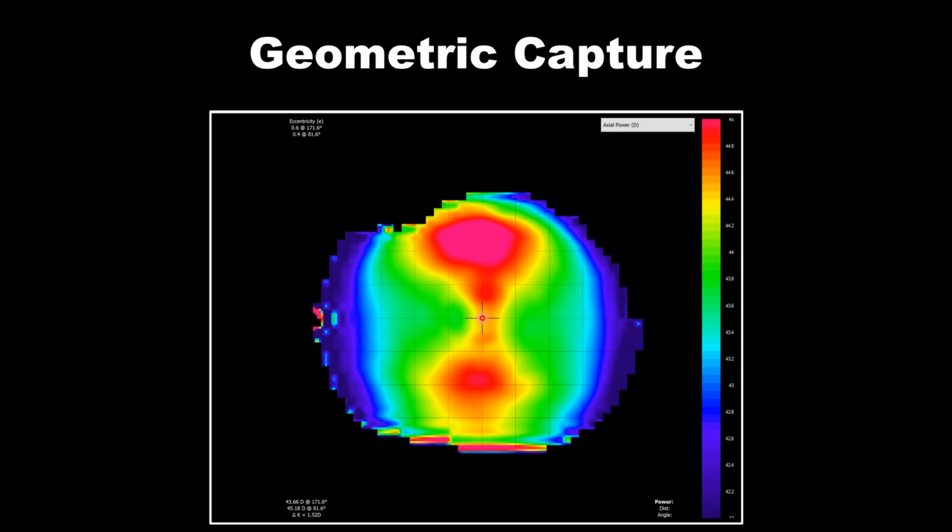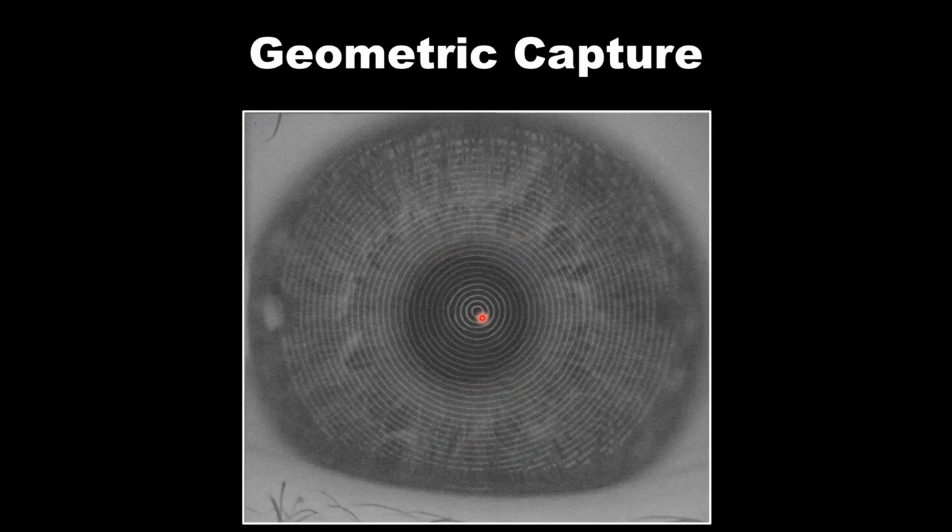photo of this cornea. Now, when we look at the Placido reflection, we see the rings relatively close on this side, about the same distance on the other side. So I've done a much better job of putting the Placido reflection on the center of the topography. However, I want you to look at a bit of the distortion in the Placido right in the center.